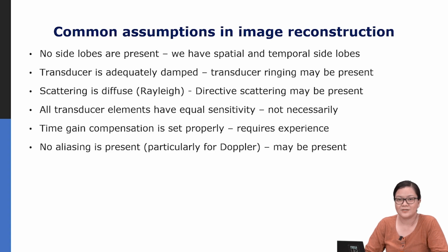Time gain compensation is also assumed to be set properly, and we've learned that time gain compensation is an operator-dependent parameter, and it requires the expertise of the sonographer to dial those TGC knobs appropriately to help visualize the tissue structure properly. Also, we assume that no aliasing is present, particularly for Doppler. But if Doppler settings are not done properly, then there could be some aliasing, which can also impact the Doppler measurements.